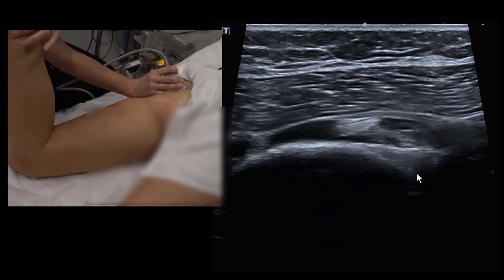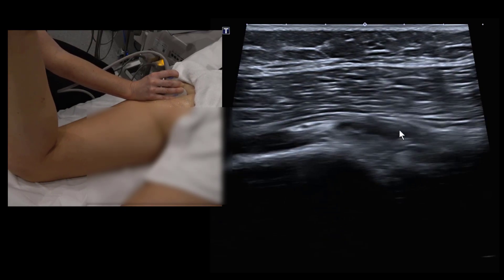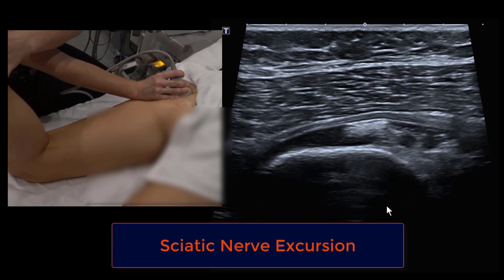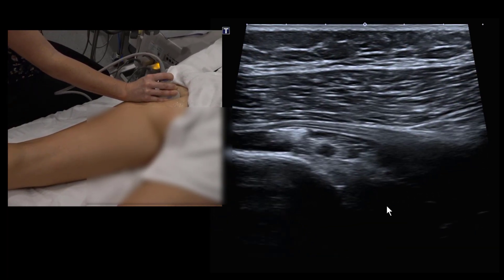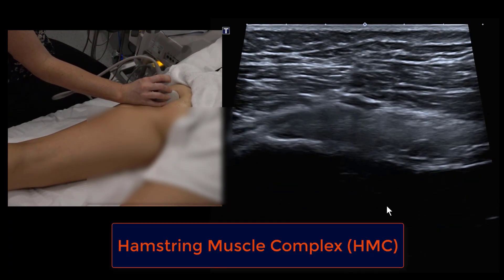For sciatic nerve excursion assessment, the prone position is not ideal because we want to activate hip flexion. We'll move the patient into decubitus. Before that, we'll look at the hamstring origin in longitudinal and transverse views.